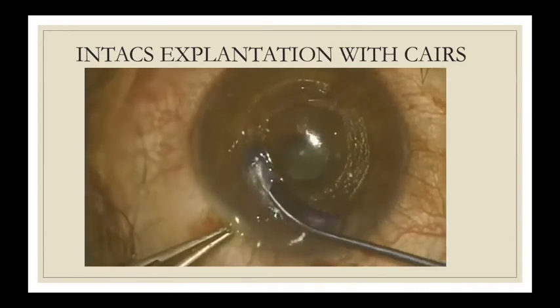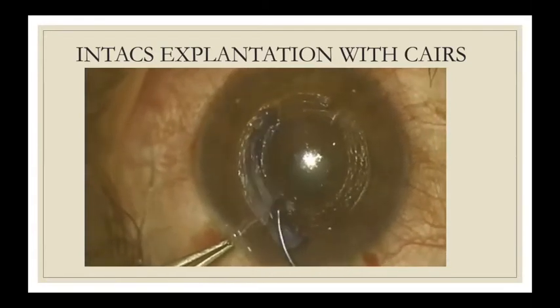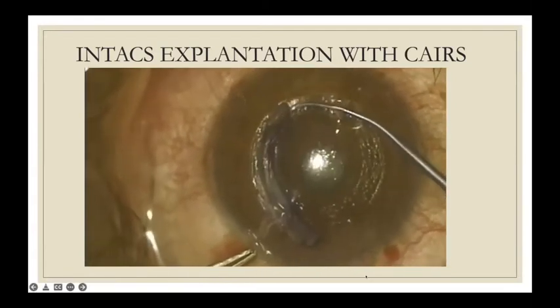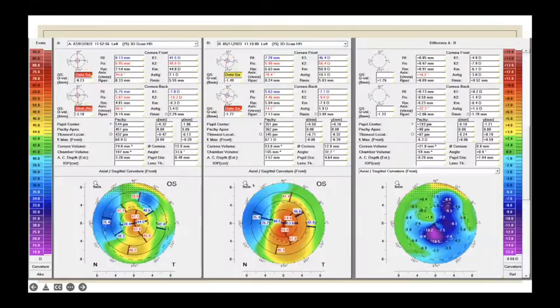I was thinking that it would be difficult, but actually it really went in very, very smoothly. We had just got to pull the CAIRS into place and everything went smoothly. And this is basically the topography of the same patient. This was just done very recently by me. This is the pre-operative patient and this is the post-operative topography.